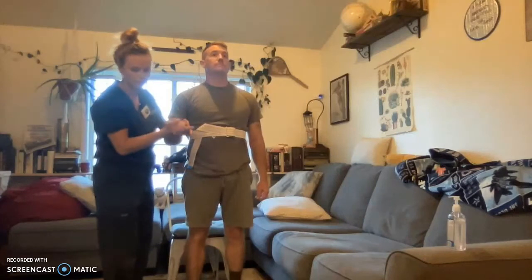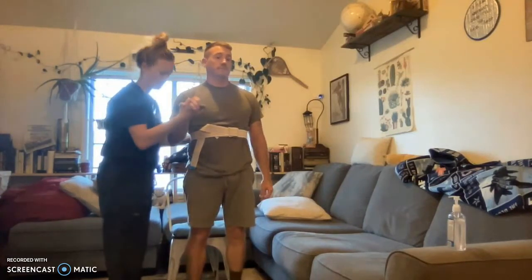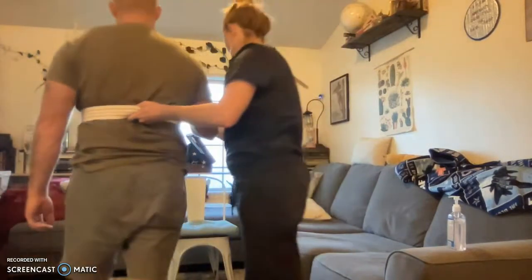Make sure to keep your head up and look straight forward just to see where you're walking. I don't want you to trip over anything, okay? Go ahead, take some steps. Go ahead and turn. I've got a good hold over the back of your gait belt here.